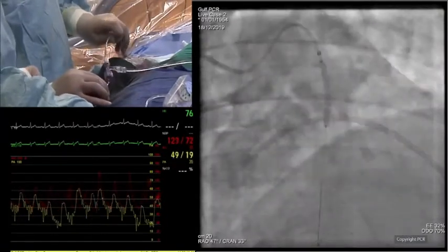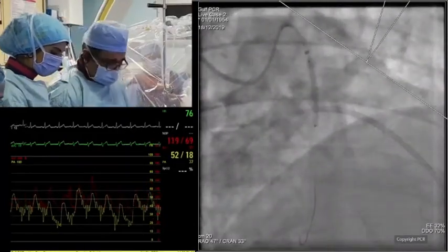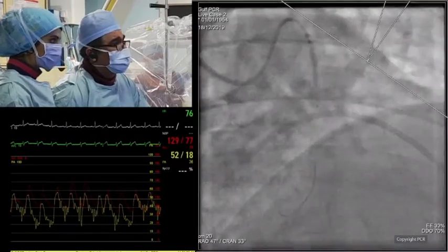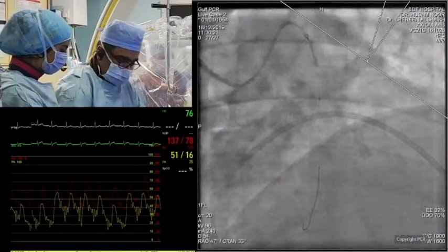It's hitting the inlet of the guide liner. Sorry, guys. That's all right. Down the balloon. Yeah. So everything came out. So I tried to save the position, but it's okay. Okay, let me just do that.